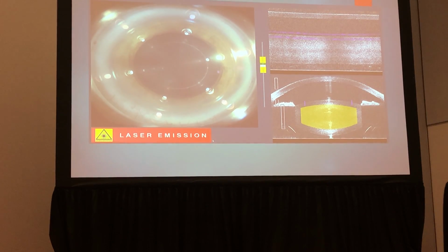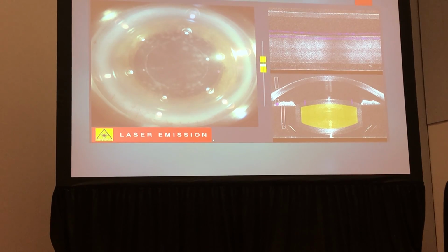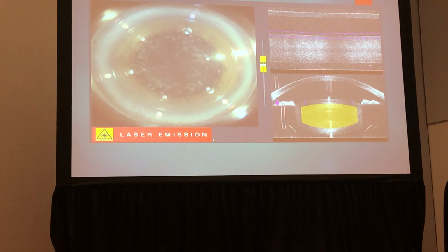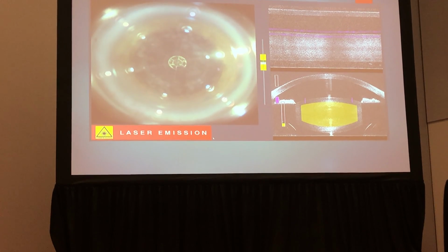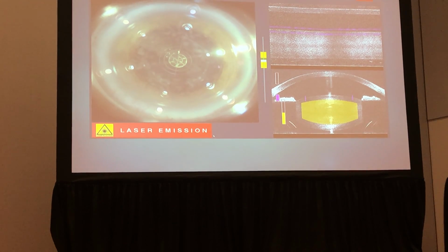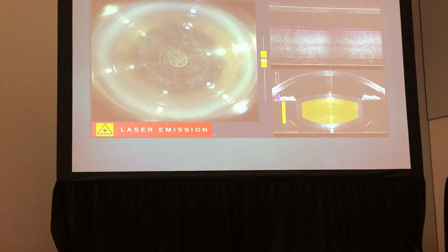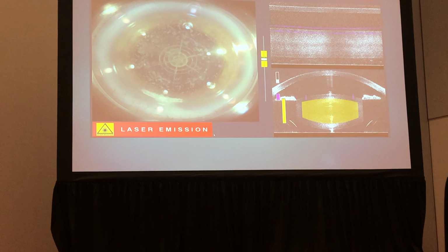We're treating now so we can see our capsulotomy going around. I always love seeing that nice 360 show up. So we have 25 seconds left. Everything is perfect. She's a perfect patient, nice and still. We're down to 20 seconds right now. Here's her frag pattern. We can see the lens fragmentation now. We're doing some spheres, and then we have 3 cuts. That looks beautiful. We're down to 10 seconds. And there's the arcs. Everything is going beautifully.